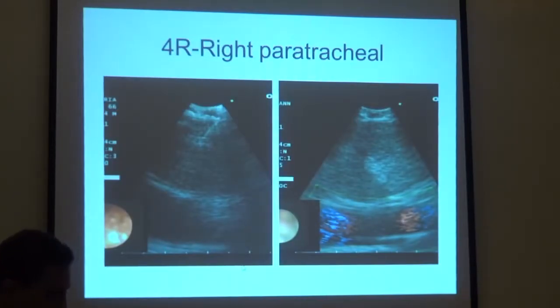This is another view showing the puncture and showing the Doppler view here. So you've got superior vena cava under it, sometimes not very clear. You could increase the contrast here and you'll have a better view. Again, with the endoscopic, you're not seeing anything on the trachea, you're against the wall, but the SVC is under it, okay?